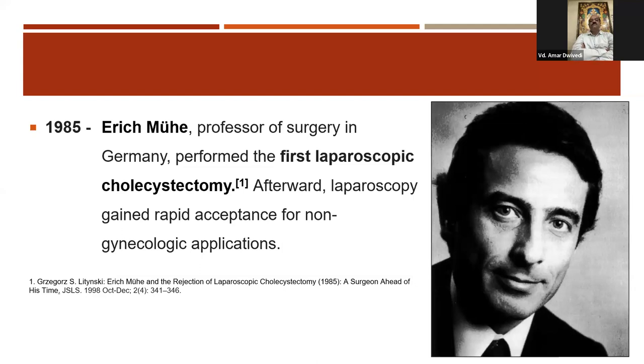But in the present scenario, there are newer developments of energy sources and many other equipment. Our cameras are also a very advanced form, three-chip, and many light sources are very advanced. So the duration of laparoscopic surgery is reduced, and many well-trained surgeons perform lap cholecystectomy in 7 to 8 minutes. This is the advancement, and it is due to the practice of laparoscopic surgery.